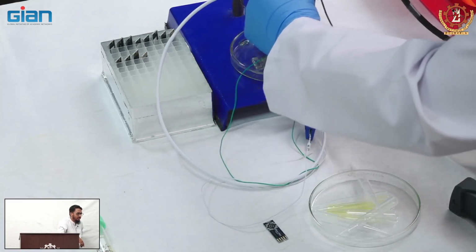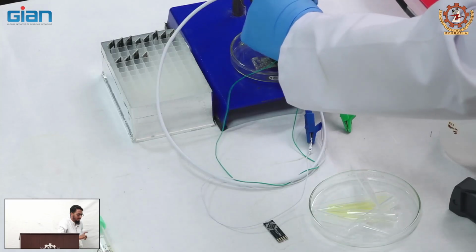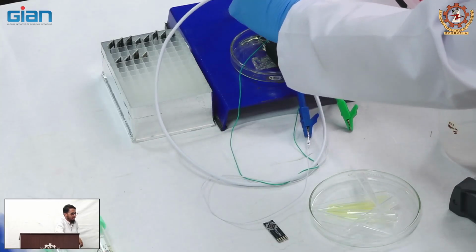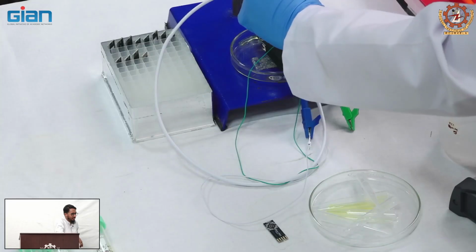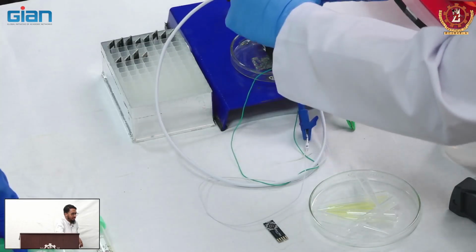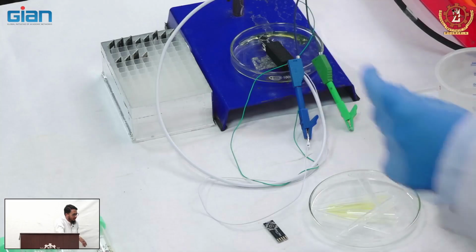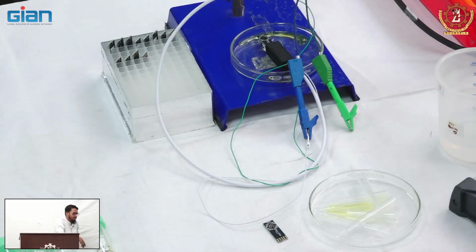So what are the concentrations of glucose that we have here? No glucose, right? 0 millimolar or no glucose. Then 2.5 millimolar, then 5 millimolar, 7.5 millimolar. So 2.5, 5, 7.5, 3 concentrations, and 0, which means no glucose. You can see on the screen all the solutions. So this one is 0, no glucose. It is just PBS.